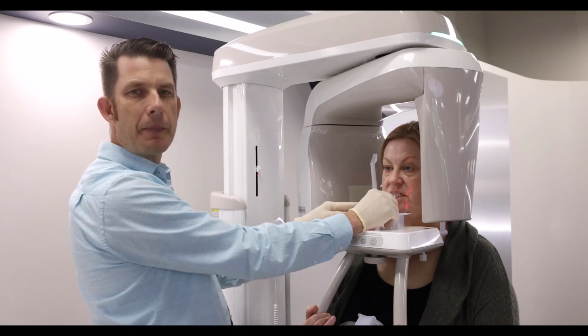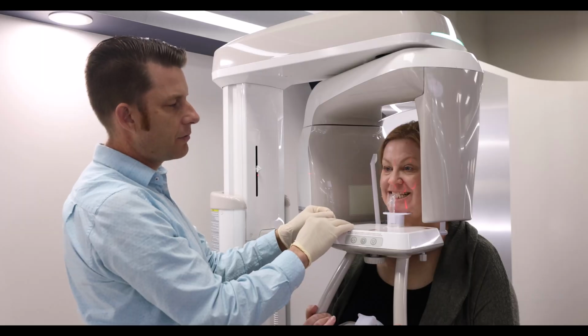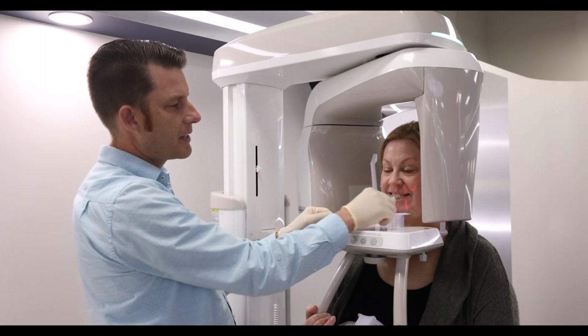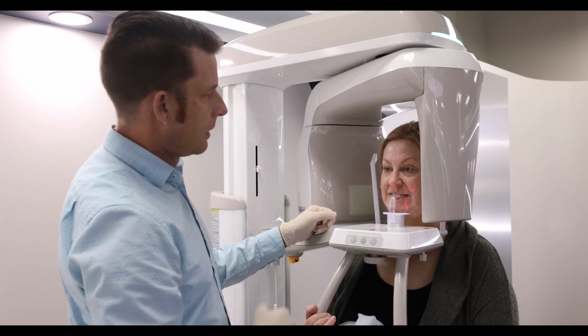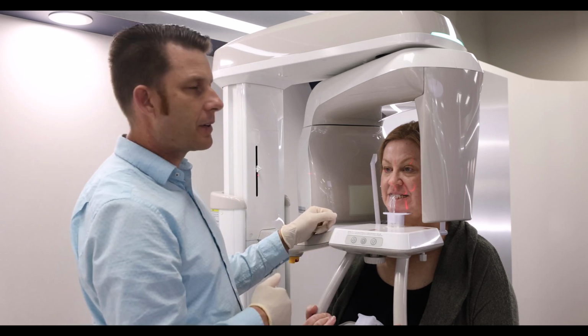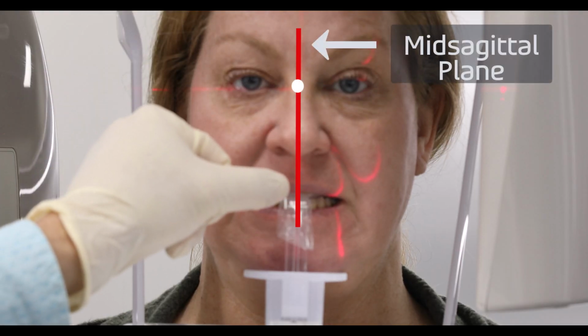With the patient biting in the bite stick, I have the patient smile, and I can see that the patient is in the bite stick groove. Next, I will push down on our bite stick to ensure their chin is firmly on the chin rest. We have several positioning beams. First, I'm going to look at my mid-sagittal beam. I want that to line up right between the eyes and right through the philtrum.